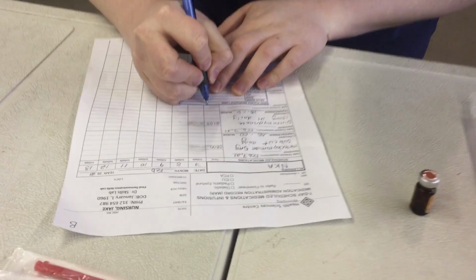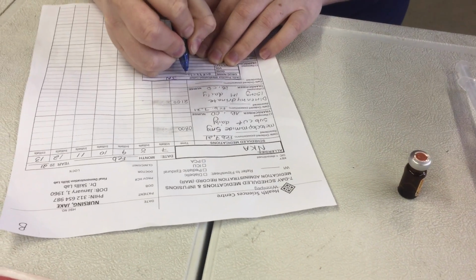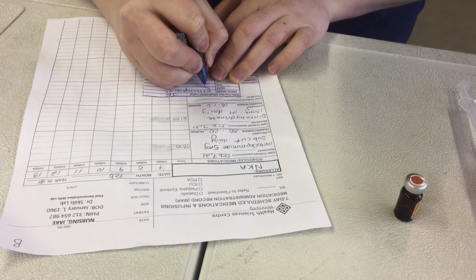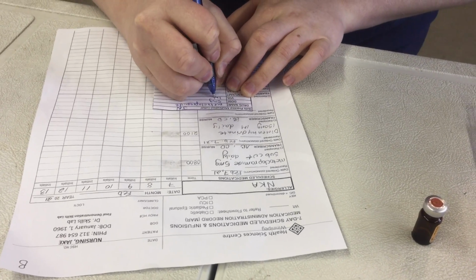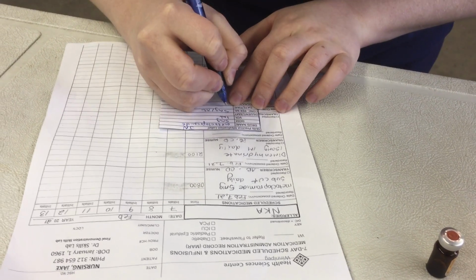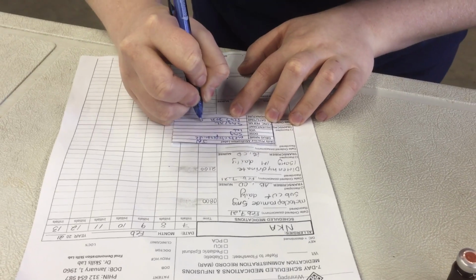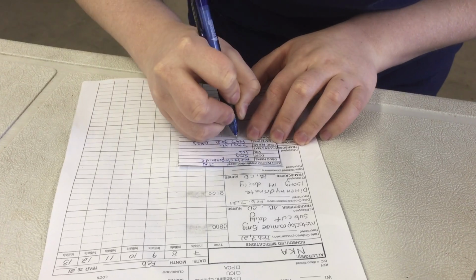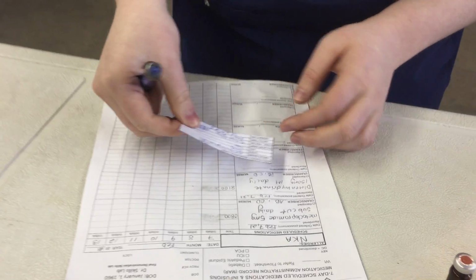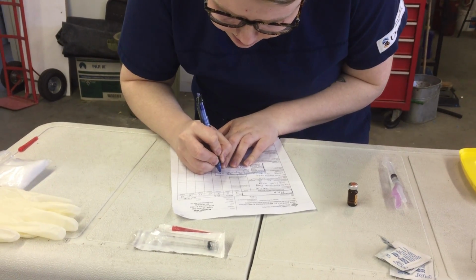Okay, so after I've done that, I'm just going to make a med label for my medication here. So we have Jake Nursing. The drug is metoclopramide. The dose is 5 milligrams. Volume is 1 ml. The concentration is 5 milligrams per ml. The date, so it's February 7th, 2021, and it is 0825. And TPUMSN2. So after I've done that, I'm just going to write that this drug is also to be given subcutaneous.